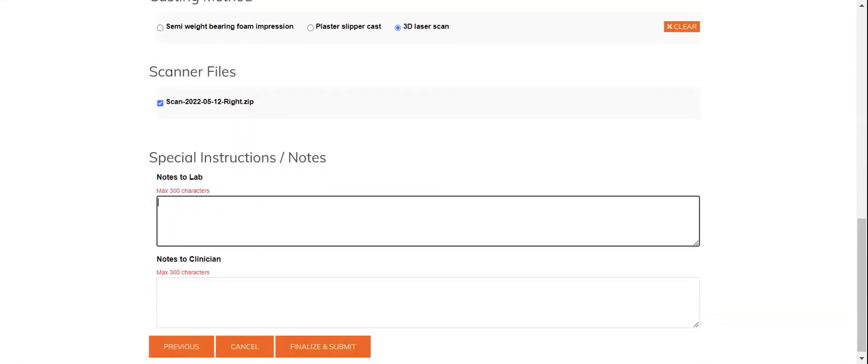Lastly, any special requests, any additional information or communication you'd like to have with our Podorthic team, go ahead and put in the notes to labs section here.